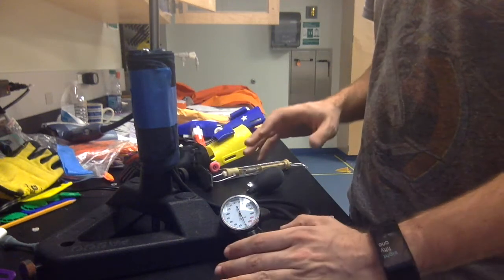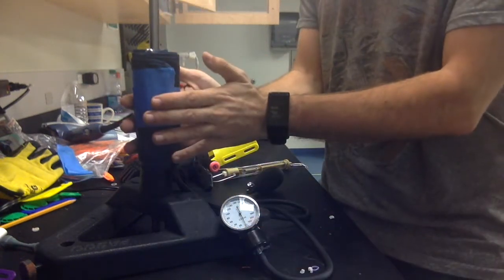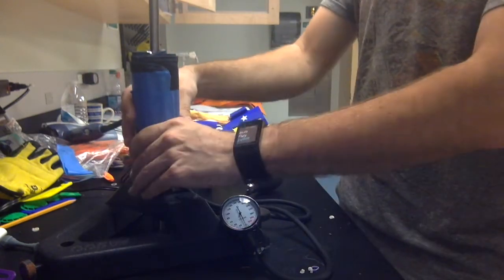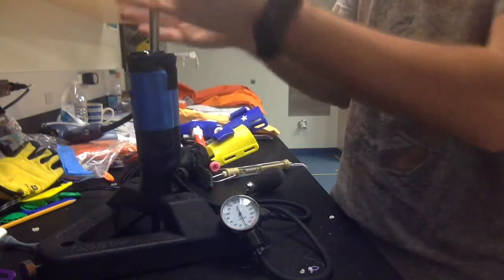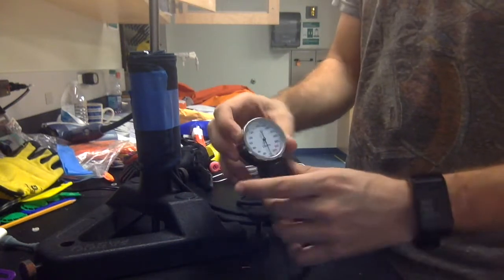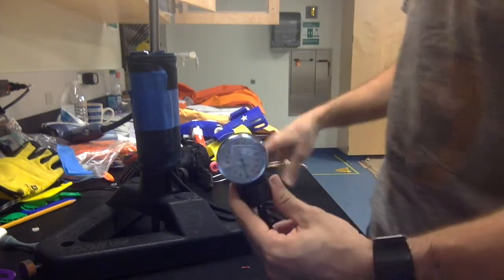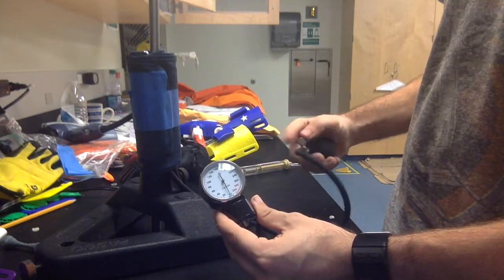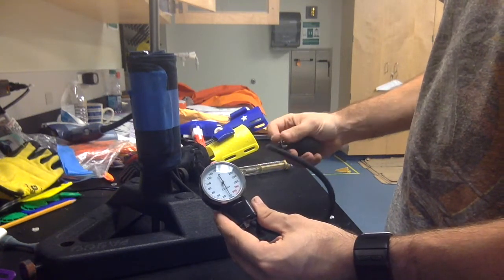For e-nable hands, what we're using is just a modified blood pressure cuff. I've taken the cuff and rolled it into a cylinder and secured it to this little stand. So we have our blood pressure cuff, and what you're going to do is inflate it up to 20 millimeters of mercury as a starting point.